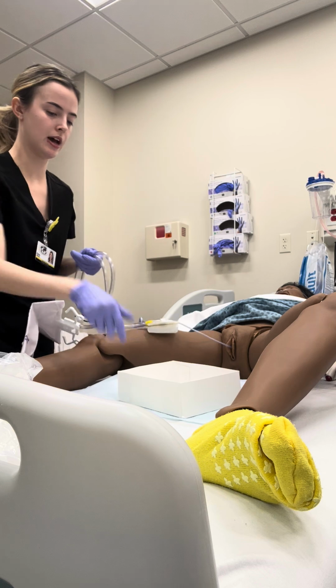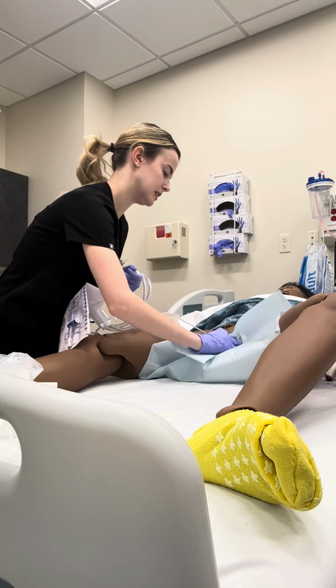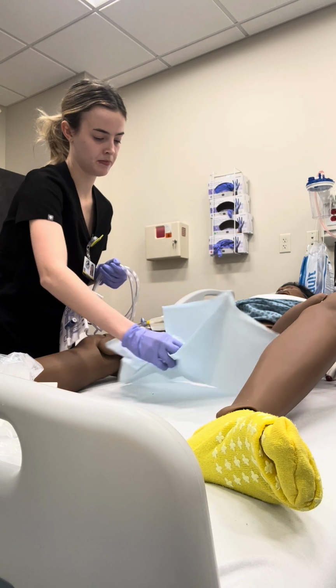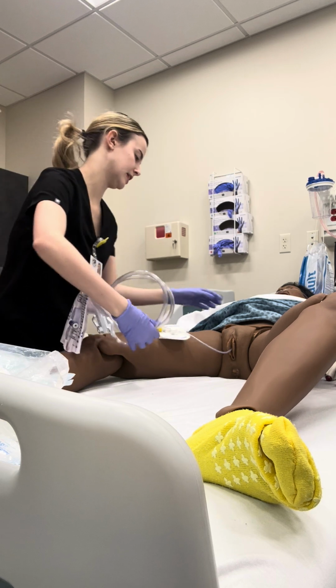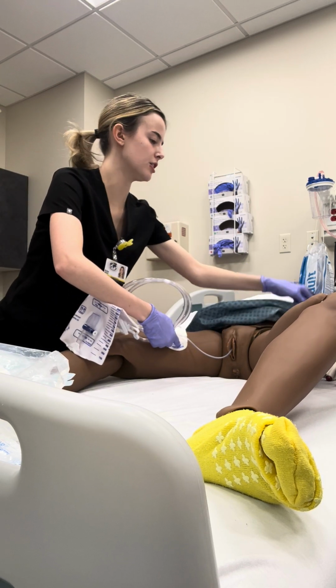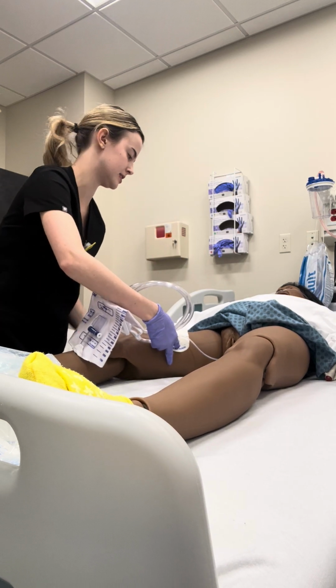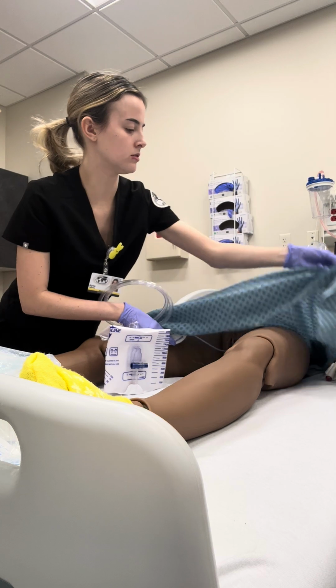So then I can go ahead and discard of this. I could use the drape to clean my patient if they had any lubricant on them. And then since that's secured, we can go ahead and lay your legs back down and you can relax. Pull that gown down.